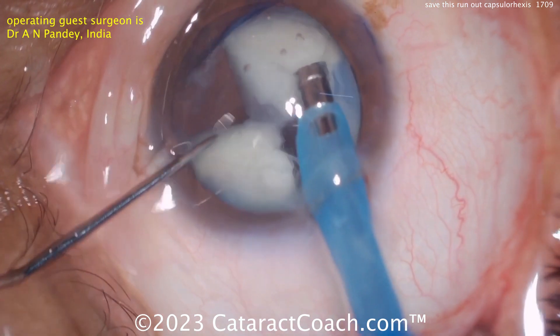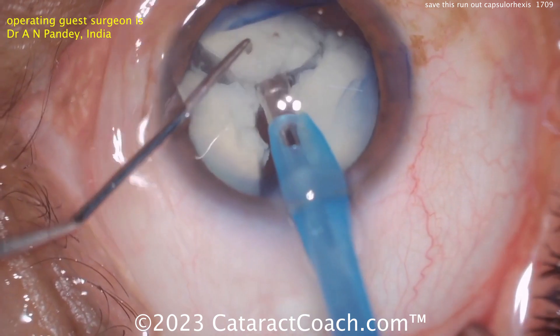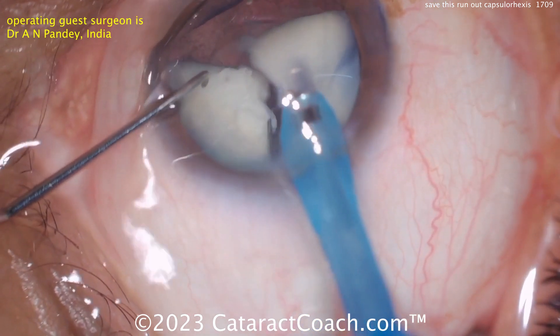It's easier to be the armchair quarterback — as we say in the U.S. — meaning it's easy to sit in my chair and watch this video and say what I could or should have done. But I think the surgeon is doing a very nice job. We're all here just to learn, not to criticize.